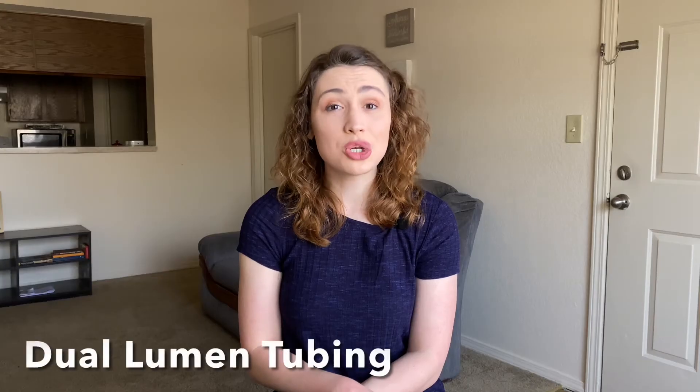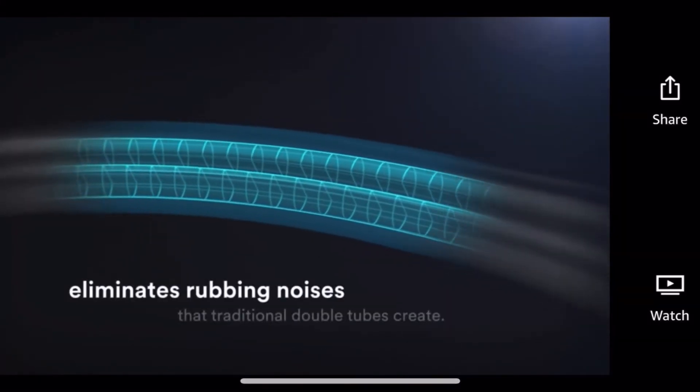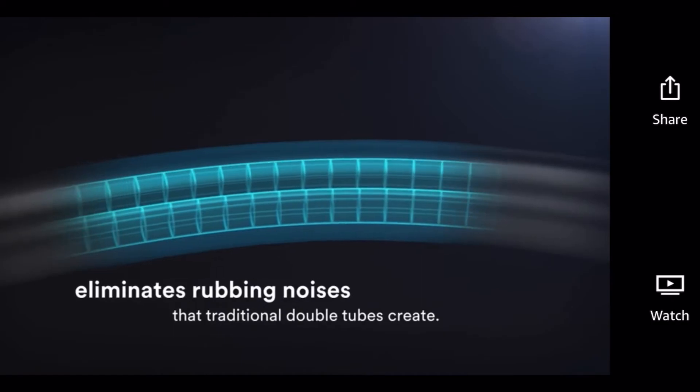The tubing on the Cardiology IV is a dual lumen tubing, which is thicker and designed to eliminate the rubbing noises caused by traditional tubing. This cuts out outside noise and improves the quality of your auscultation. However, if you wear it all day, the thicker tubing can cause some neck issues by the end of the shift.